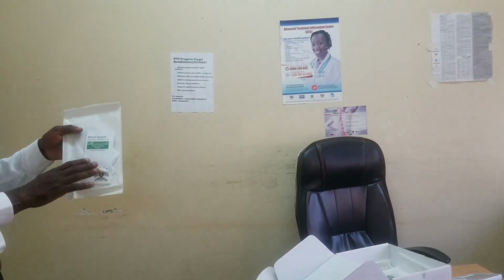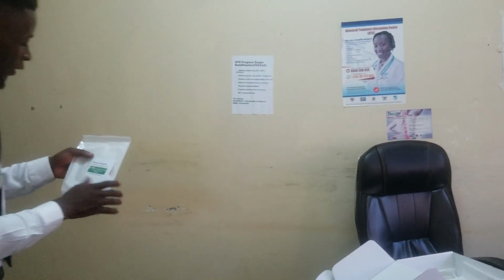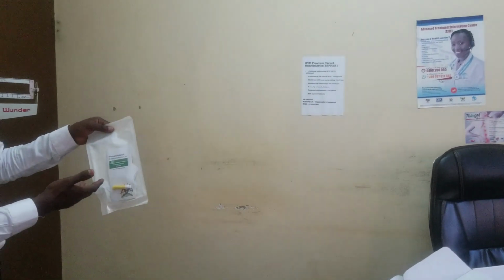This is number 10. So in number 10, we shall have a reference blood sample. So what happens with the reference blood sample? Reference because we have been taking different samples for DNA. So we need the reference.